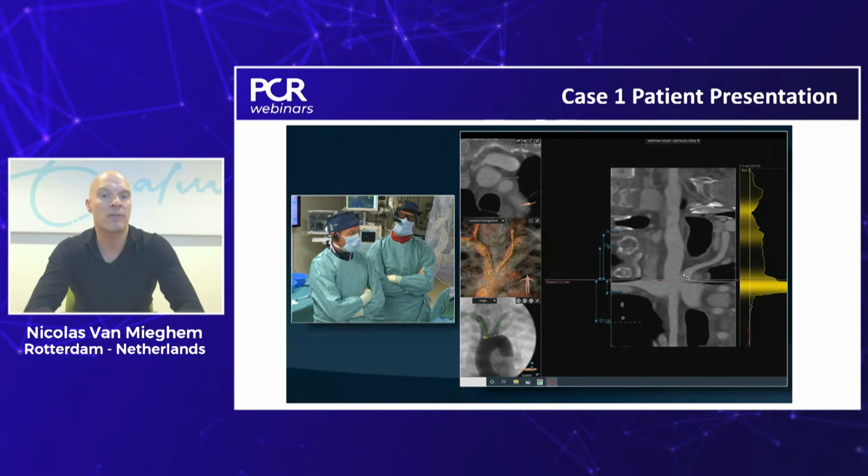I think in terms of patient selection, Darren, we may ask Mauricio from a surgical perspective, is this a surgical candidate or would he feel comfortable with TAVI? Thanks for the question. Well, as you said, obviously, looking at the numbers, this is a potential surgical candidate. Of course, I would say this is for sure not a low-risk patient, independently from the STS, for two reasons. One, the one that you mentioned, chronic immunosuppressive therapy and corticosteroid therapy, that we know make the tissue quality much more frail than usual. So obviously, this is something that we have to consider.